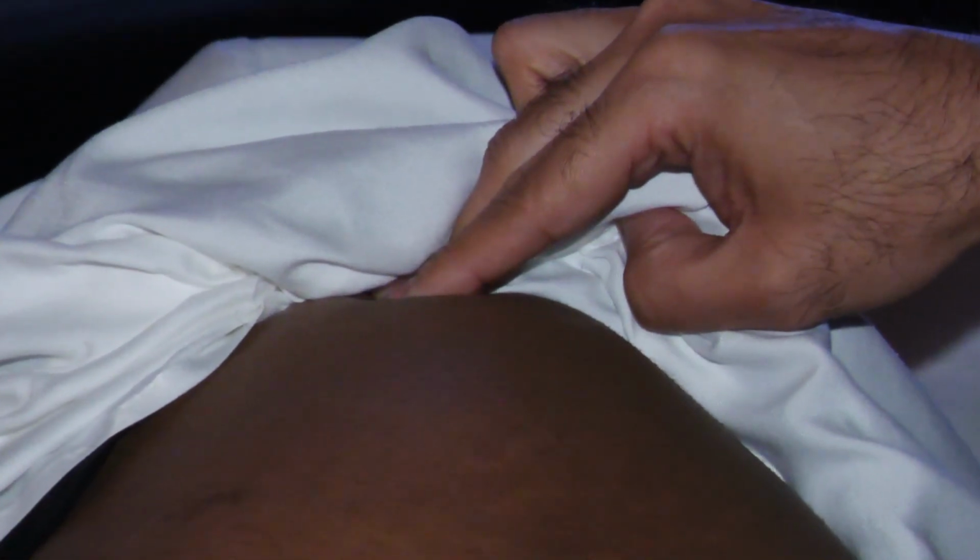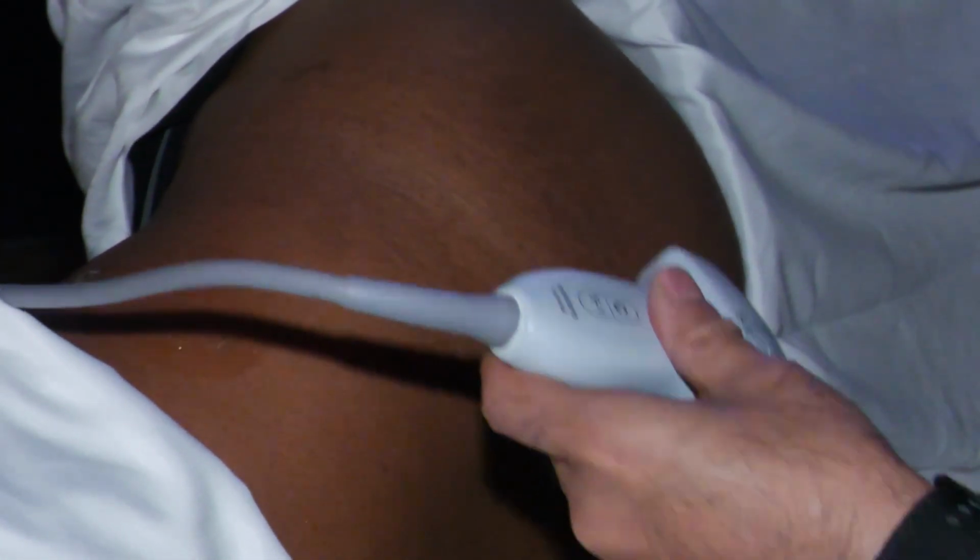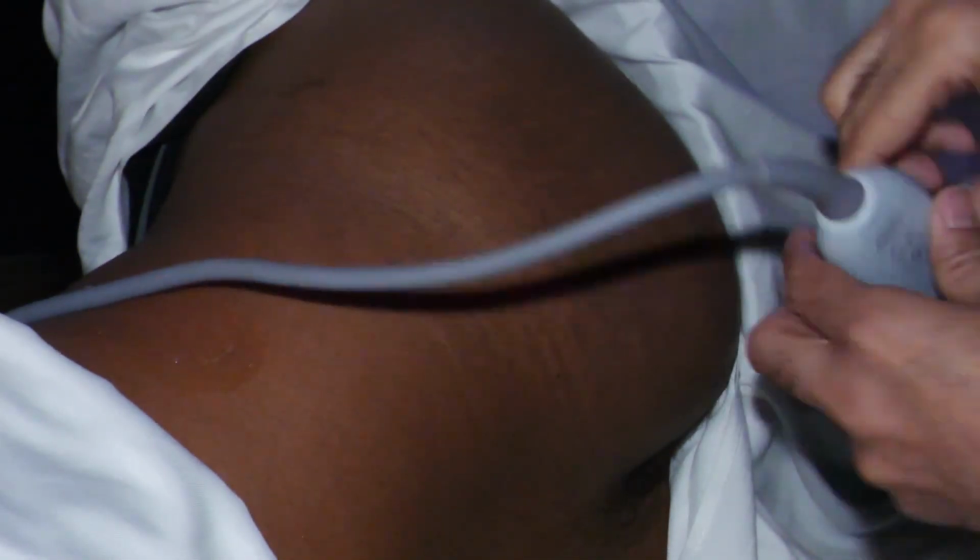So how do you recognize that this is the greater trochanter, my dear friends? Slide your hand onto the lateral aspect of your thigh. As you move upwards towards the hip joint, the most prominent point is your greater trochanter. So if I draw a line in between these two and bisect it, on the medial half, if I keep my probe, my dear friends, I'll be visualizing the ala of the ilium with three muscles, gluteus maximus, medius and minimus. So can I have jelly, please?